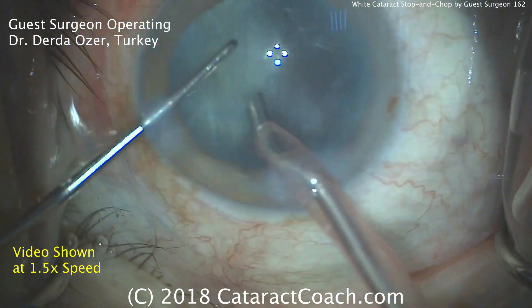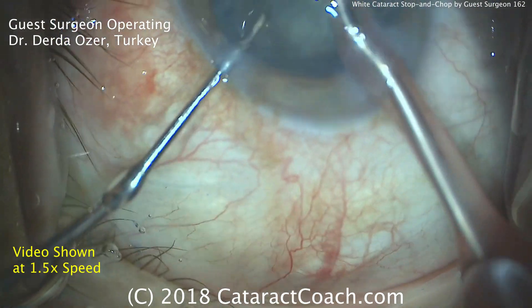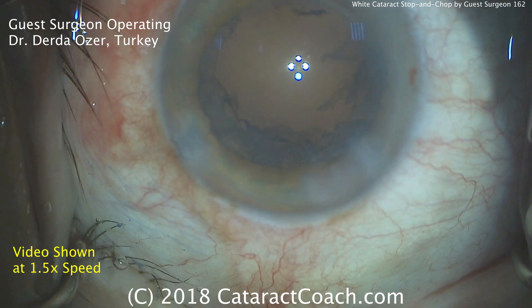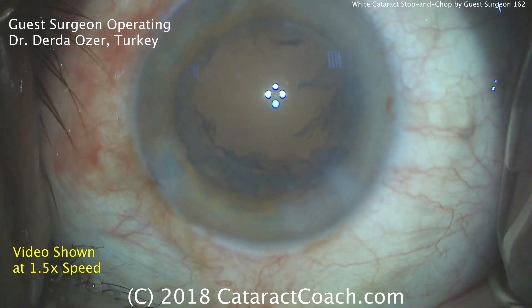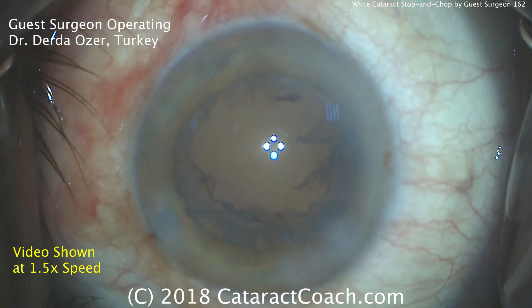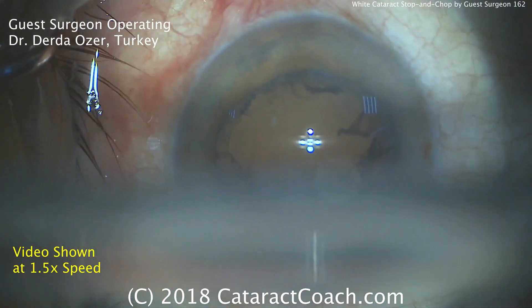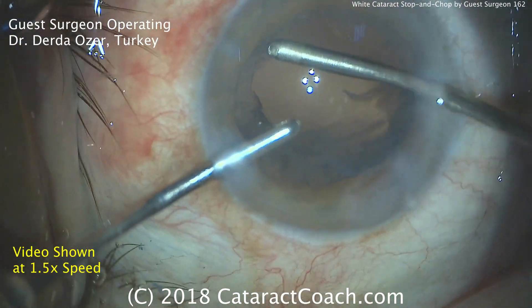It looks like the surgeon is sitting temporally. Here's the second half of the nucleus, also being emulsified and further chopped — it comes out quite rapidly. Very efficient removal of a tougher nucleus. Now it's time for cortex removal. The surgeon has used two paracentesis incisions, so it will be bimanual irrigation-aspiration, which is certainly useful to access 360 degrees of the capsular bag. Here's the instrumentation: left hand is the infusion, right hand is the aspiration, removing this portion of the lens cortex.